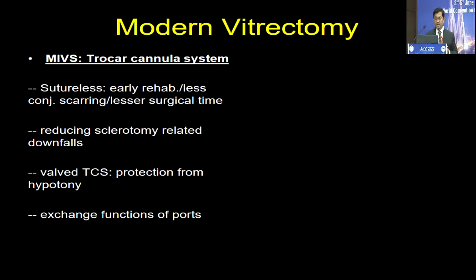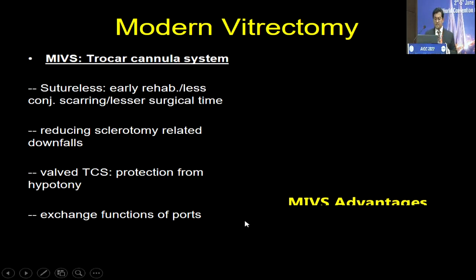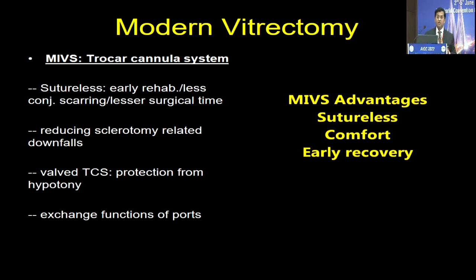What has changed the success rate is the sutureless vitrectomy, the high-speed cutters. Now this has made rehabilitation much better.